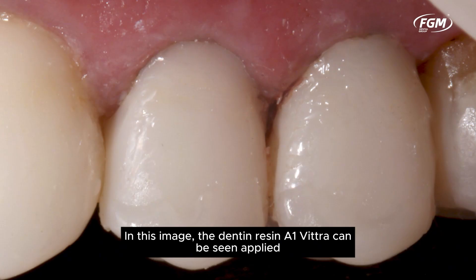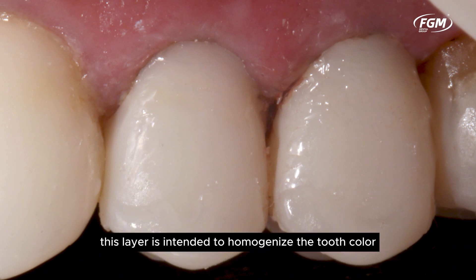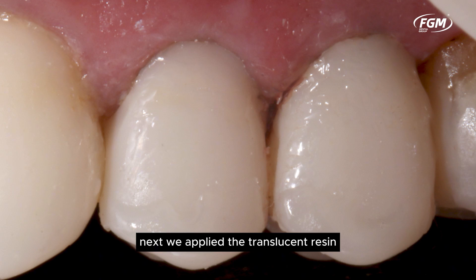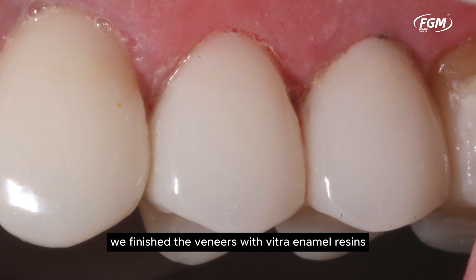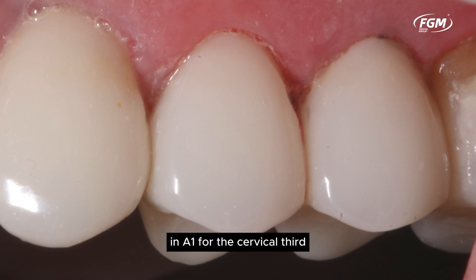In this image, the Dentin Resin A1 Vitra can be seen applied. This layer is intended to homogenize the tooth color. Next, we applied the Translucent Resin Transend by Vitra on the incisal third and a light brown pigment on the cervical third. We finished the veneers with Vitra enamel resins in A1 for the cervical third and BL3 for the middle third.